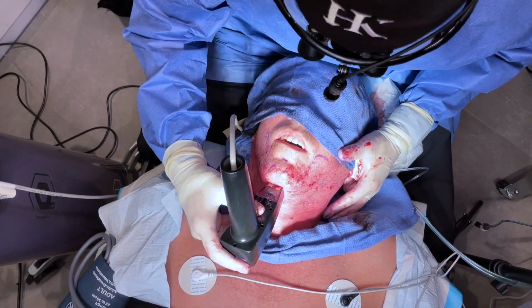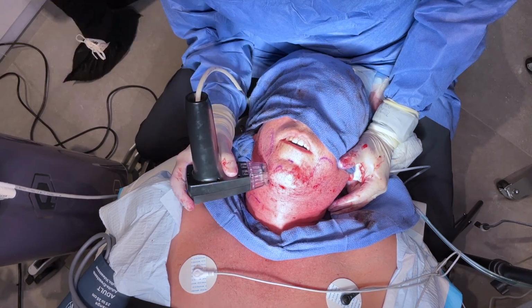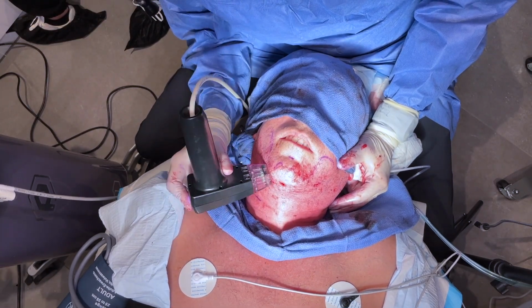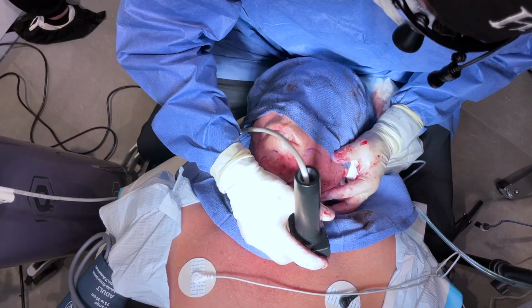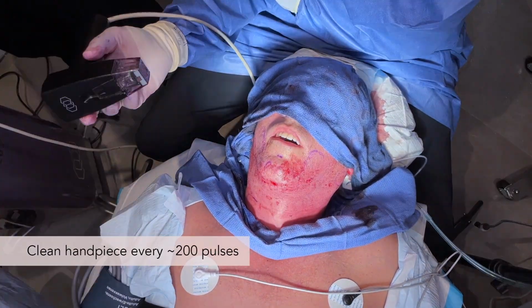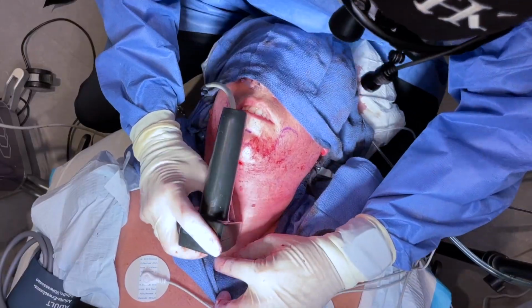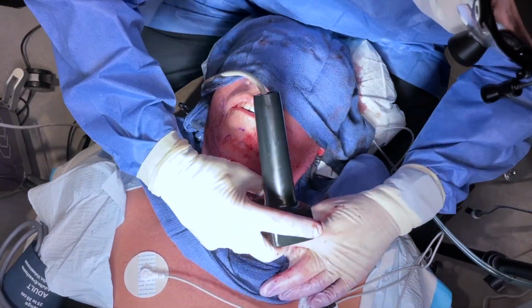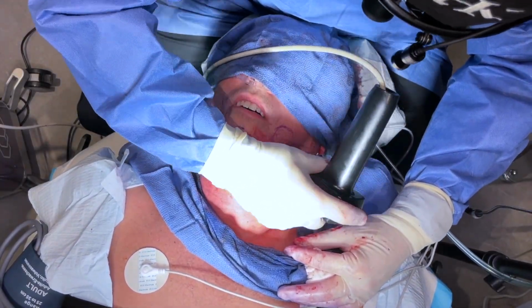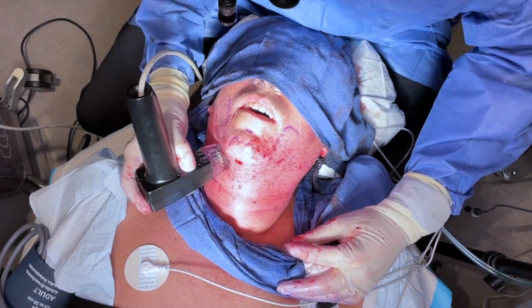Once we're done with the liposuction, in this case, we're also going to do Morpheus 8 because this patient has an excess amount of skin laxity in the neck area. We're doing subdermal skin tightening. We're also doing external skin tightening. Here you can see us cleaning the tip after 200 pulses. Most necks require about 600 to about 1,000 pulses. We are typically doing 2 to 3 millimeter depth.